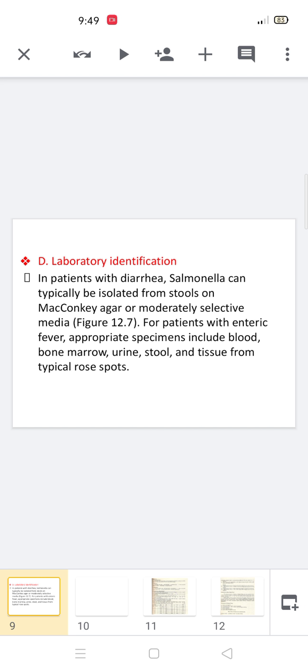Here we take serologically the titer of the antibodies by the tube dilution method, as well as we perform this test on a glass slide. In the Widal test, we measure the antibody titer against different salmonella antigens, which are known with us in the form of a prepared kit.